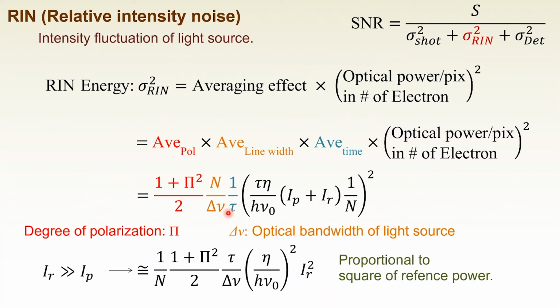Again, this one is averaging over time. The more the exposure time, the more the averaging. So it's the inverse of the exposure time. The larger T results in a larger reduction, I mean, a smaller reduction factor close to 0. Right? If T becomes infinity, this factor becomes 0 and no ring.